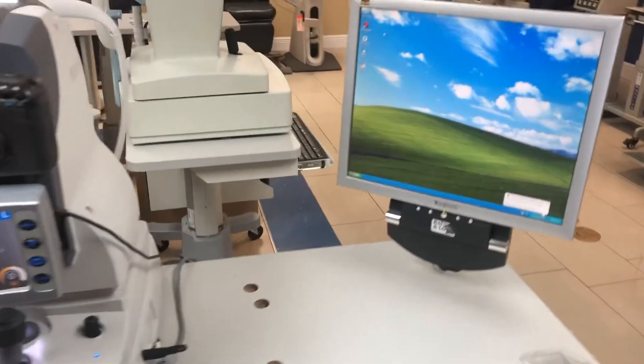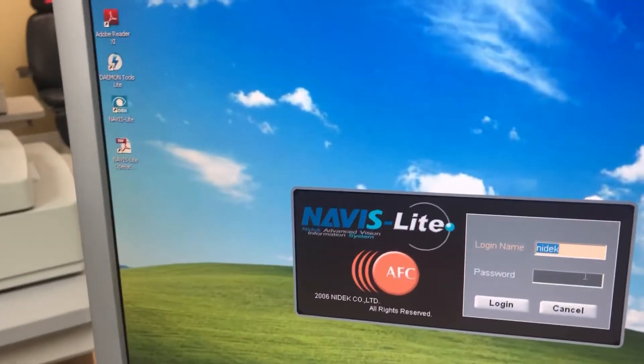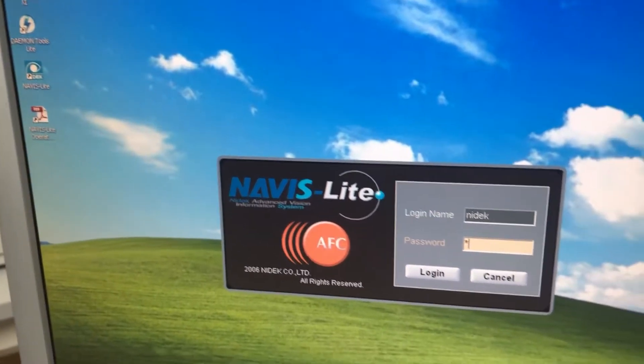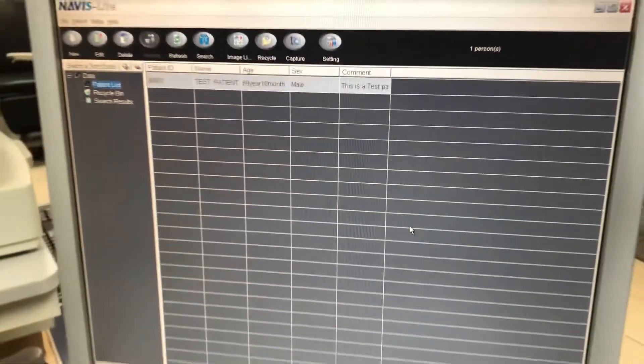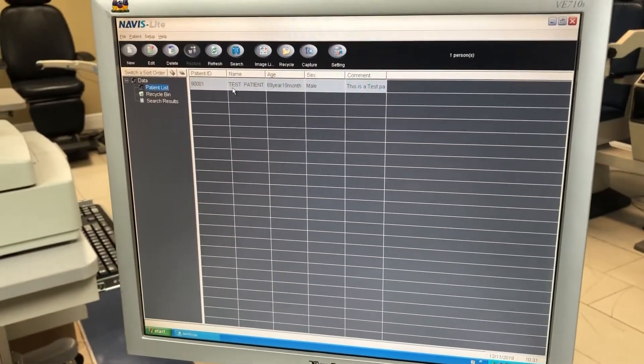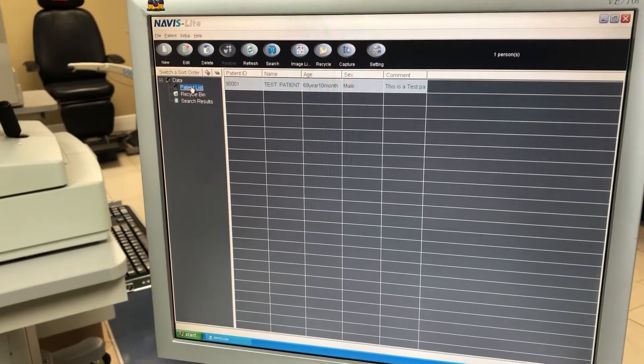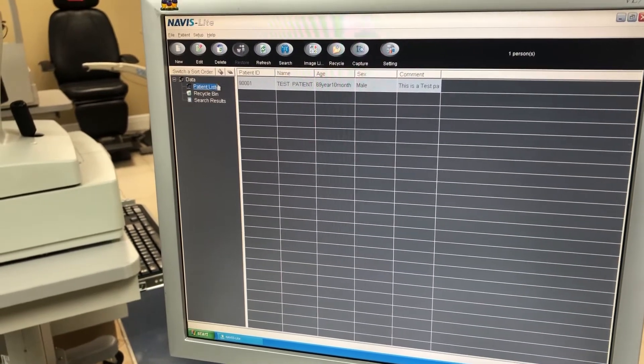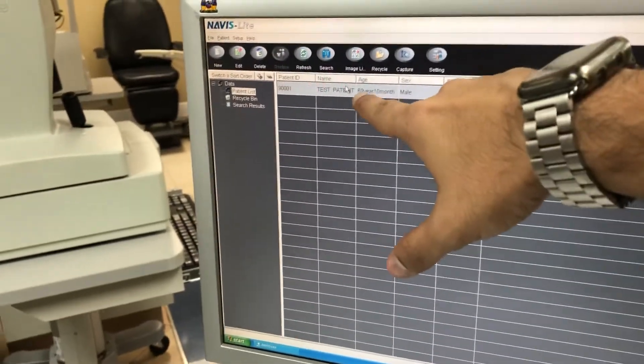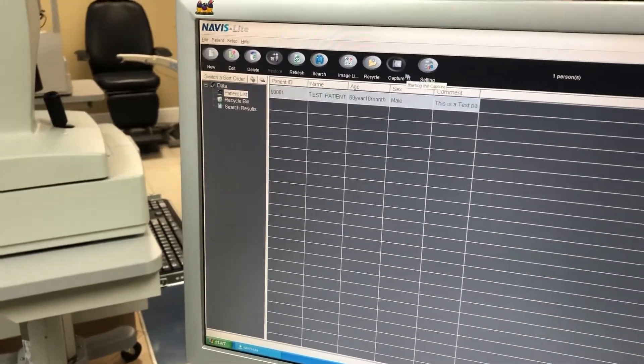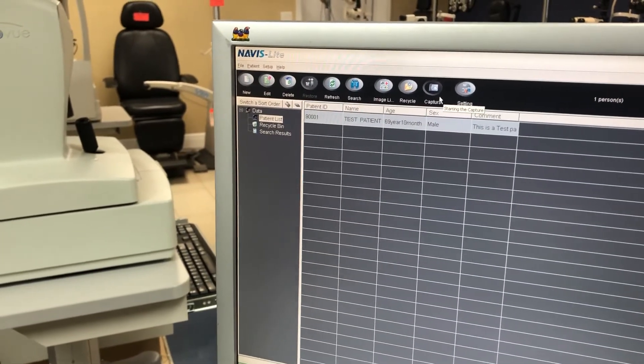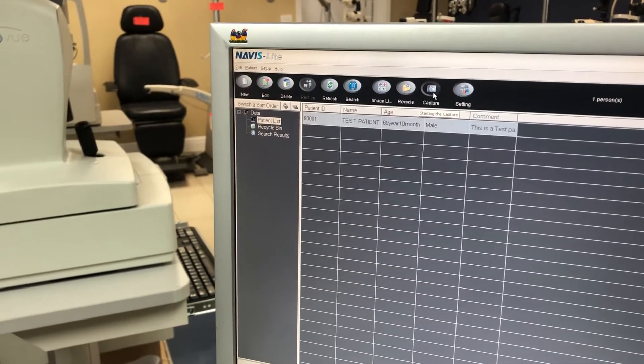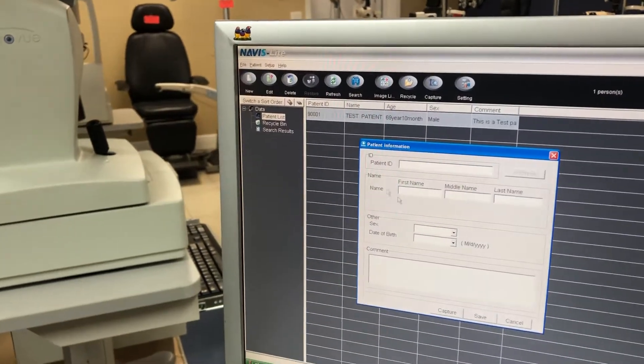We're going to open up the software, Navis Light. The password is NIDEC. Here you can see the software. We're going to open up the patient list - you can see there's already a patient on file, but you can also create a new patient. Here we're going to start from scratch and create a new patient.